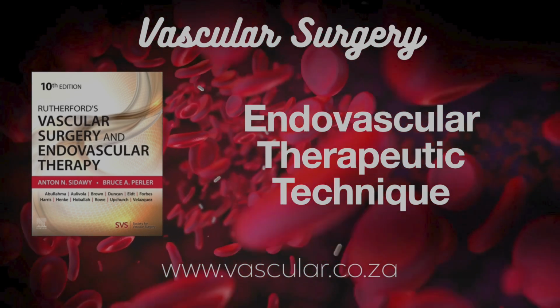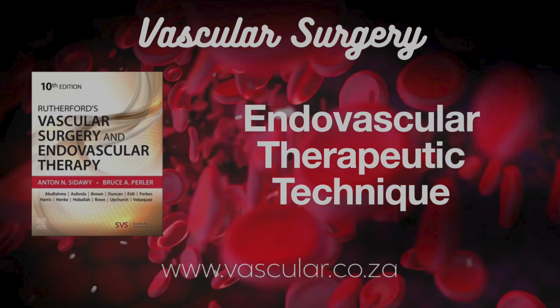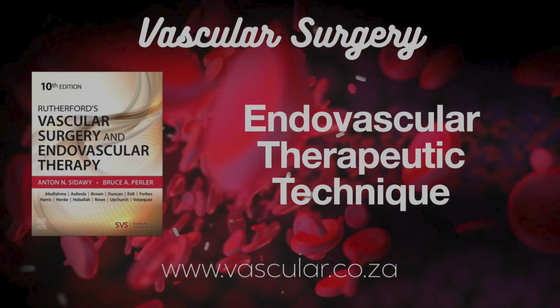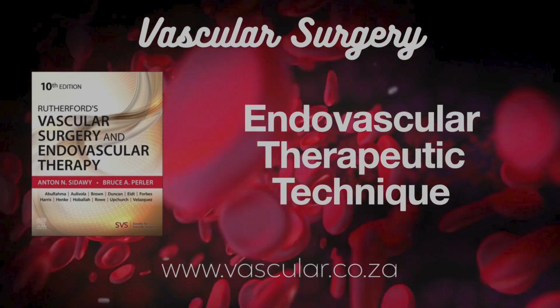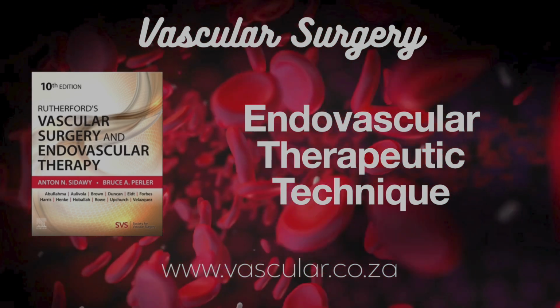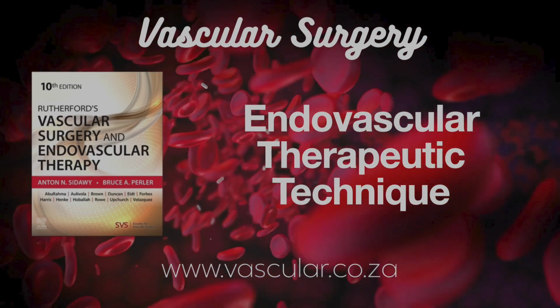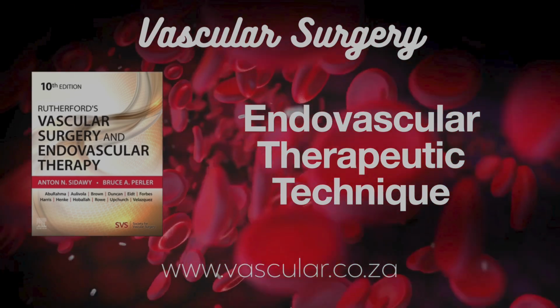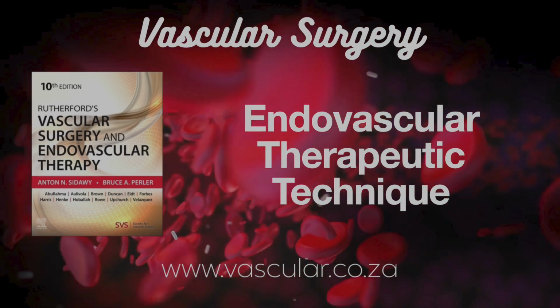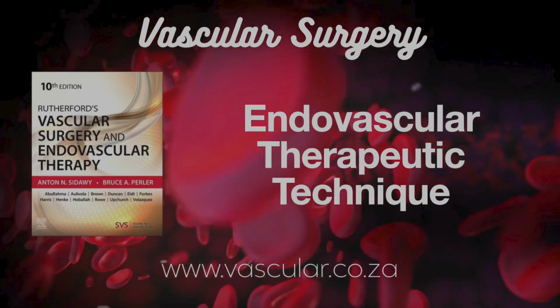Actively breaks it down. Yes. The vortex draws clot in, the jets fragment it, and it's aspirated out. The PEARL Registry for Acute Limb Ischemia showed high procedural success and good outcomes at 1 year with AngioJet. Also used for DVT, the Venous Stent Registry showed high success for iliofemoral DVT. The advantage is actively removing clot, potentially needing less thrombolytic drug infusion.